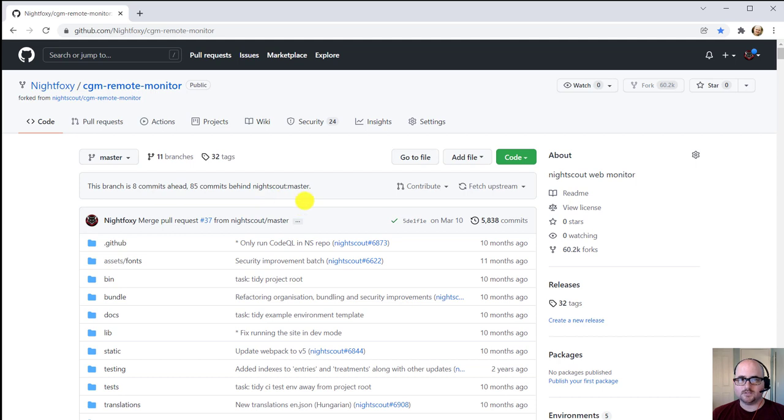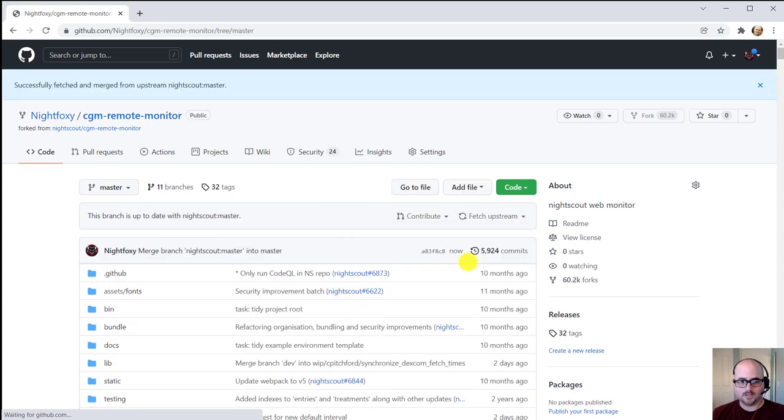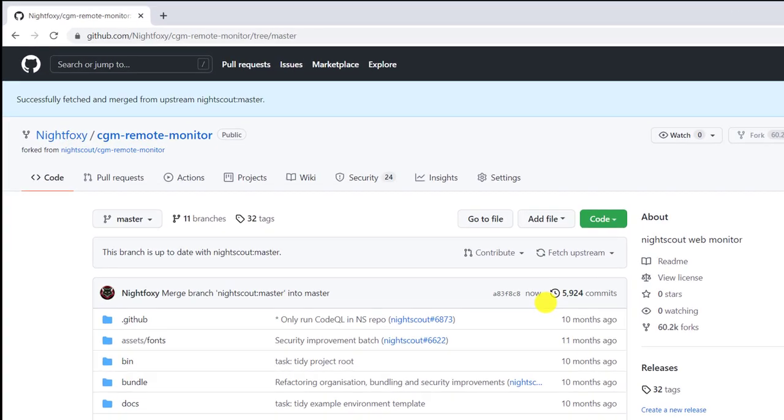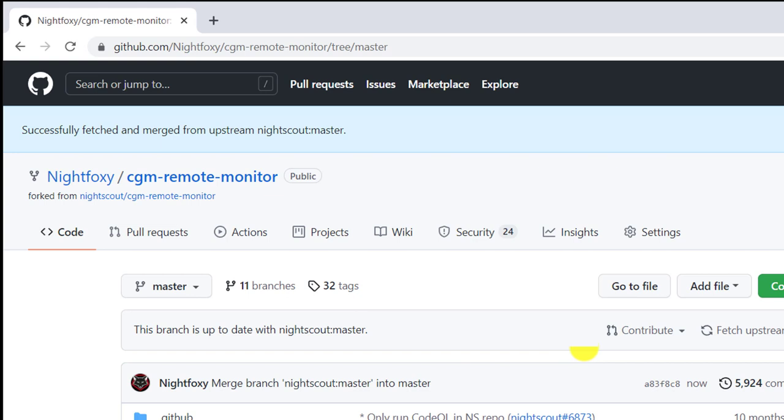So what we're going to do to update this, it's gotten a lot easier. We are going to click on Fetch upstream. You're going to have the option to Fetch and Merge. What it's doing is going to the main NightScout repository and pulling in and merging in all the changes. You can see that we merged just now. So now we're all up to date. Our copy of NightScout is updated in our GitHub.